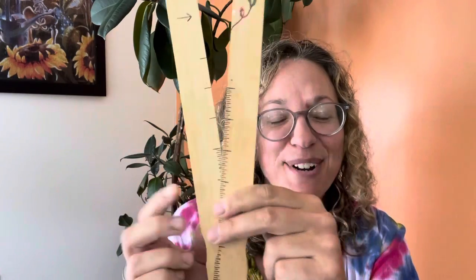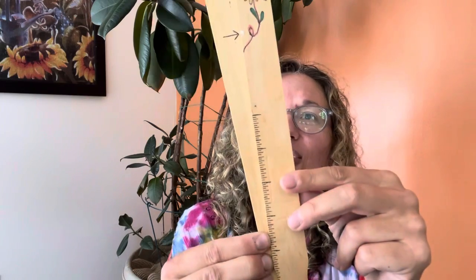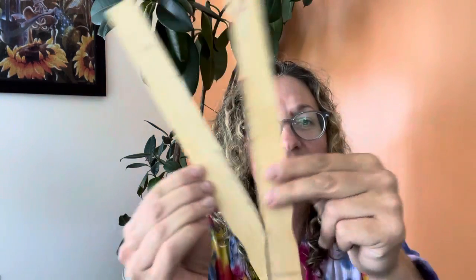But before it came in the mail, and me being as impatient as I was, I wanted to know the numbers immediately that next day. I had to show this. My neighbor fashioned me my own goniometer. See the little hash marks to measure. And then he put a beautiful little flower because I love flowers. But it's two paint stir strips fashioned together with a bolt. And all it did was the same concept as the goni. So while I was waiting for Amazon to deliver me my goni, we had our own.